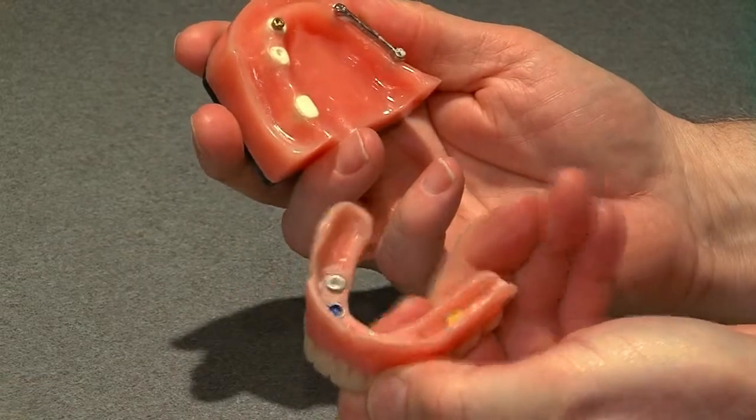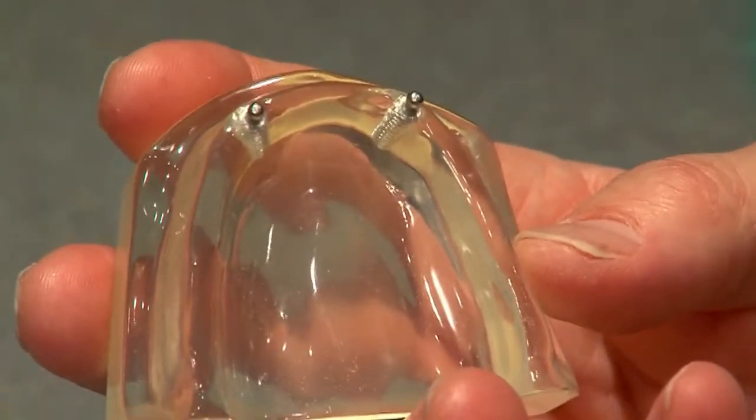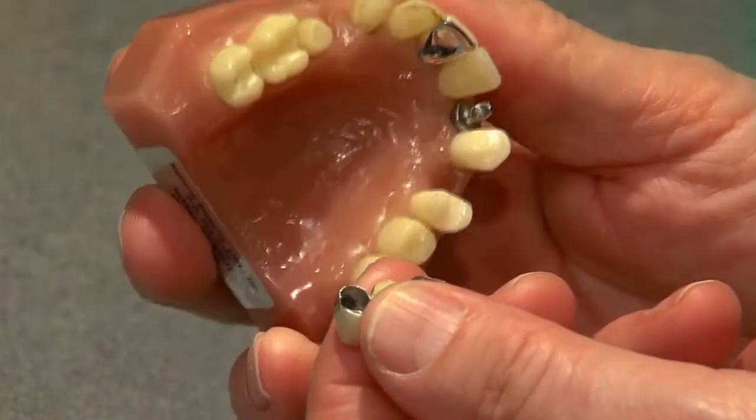Dental implants are titanium cylinders that are placed in the bone of the jaw. They're used to adhere individual crowns or teeth or even dentures. Titanium is used because bone actually fuses to the metal. So you can use them when there are no teeth, or you could use them if you lose a single tooth. Rather than doing a bridge where you grind down the adjacent teeth, you could put the single implant in where you don't touch the adjacent teeth.